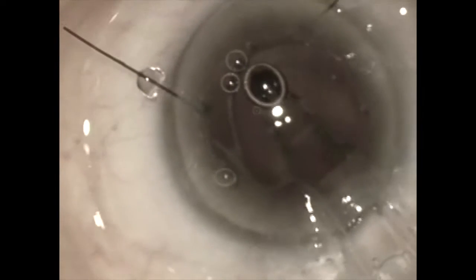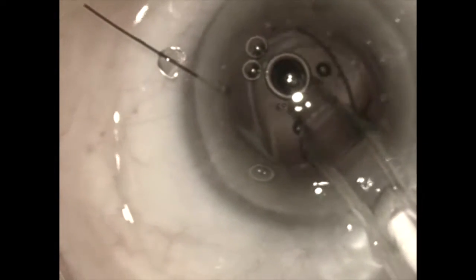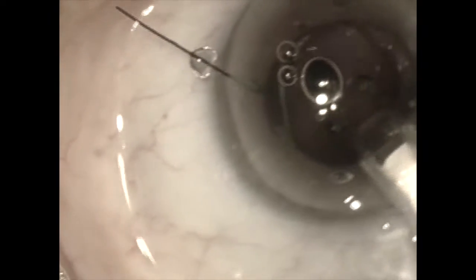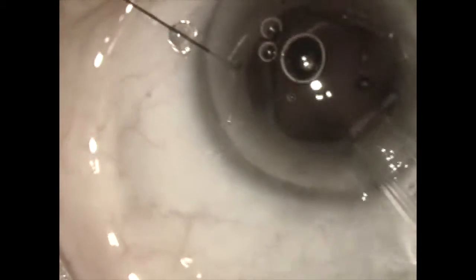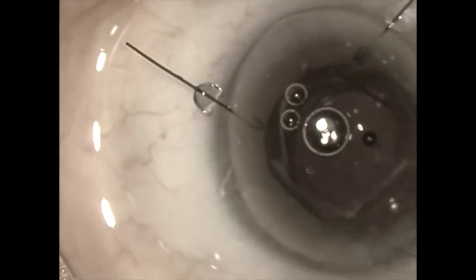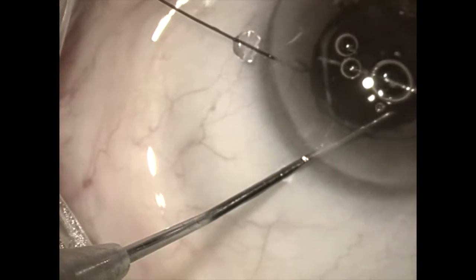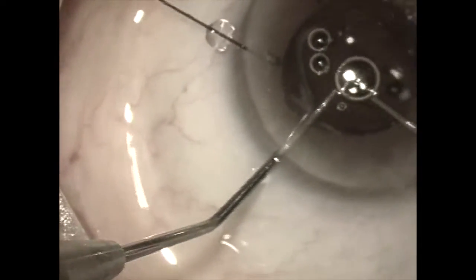The new lens being placed in the eye is a Bausch and Lomb three-piece silicone lens. This is a soft IOL and will first be injected into the capsular bag and dialed completely into the bag.